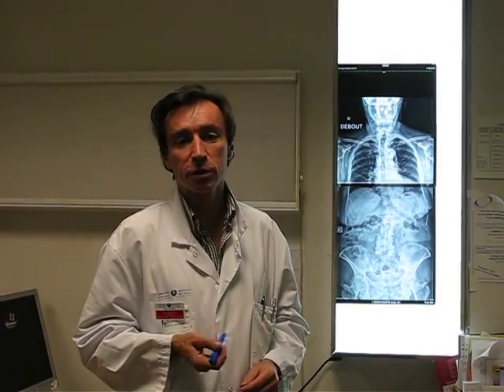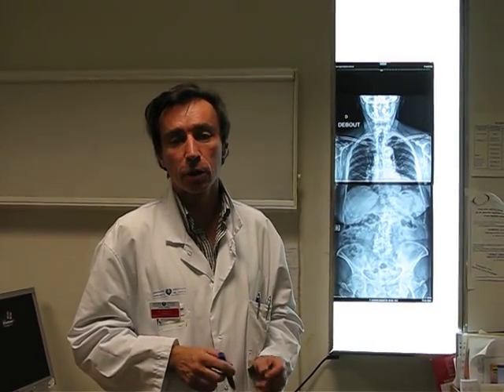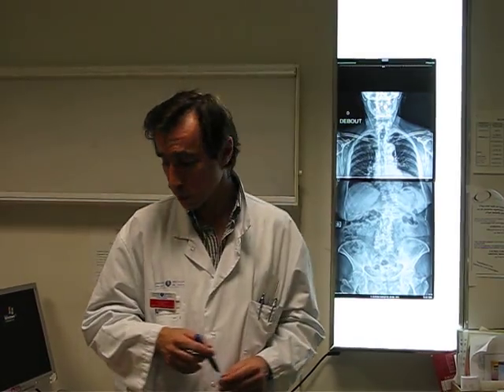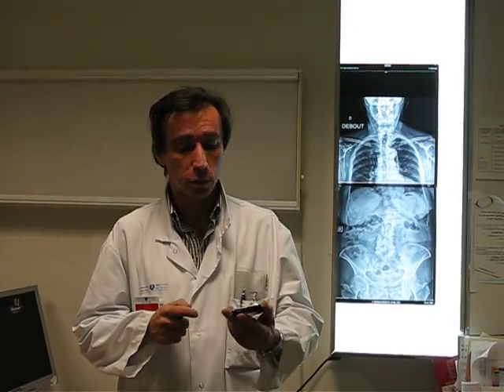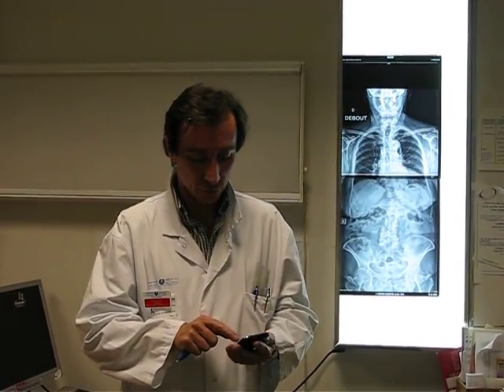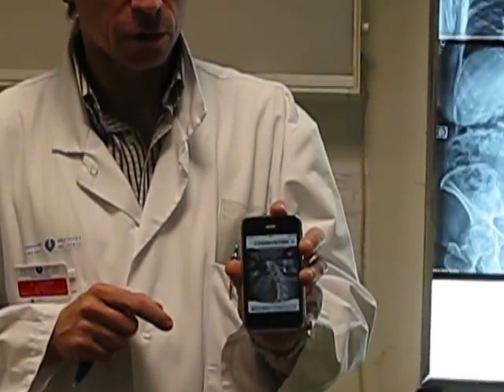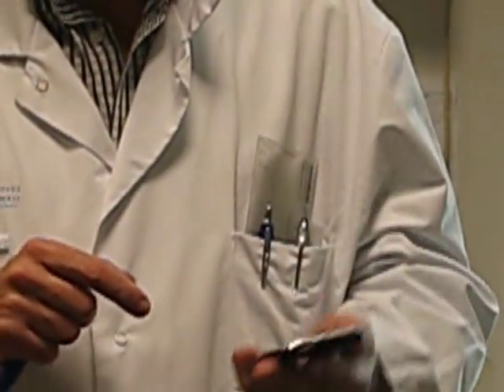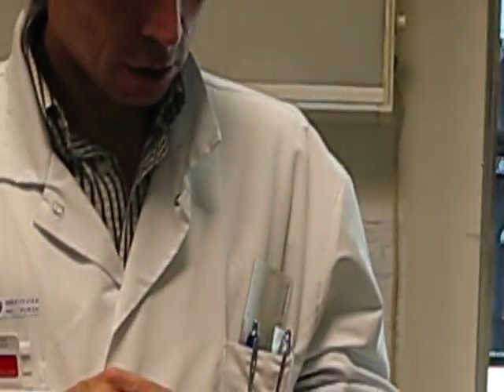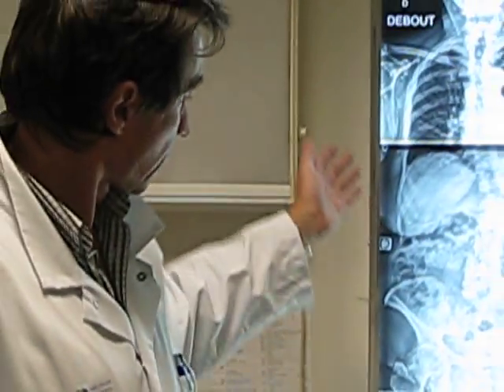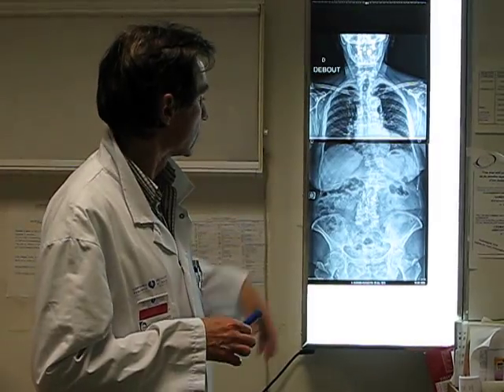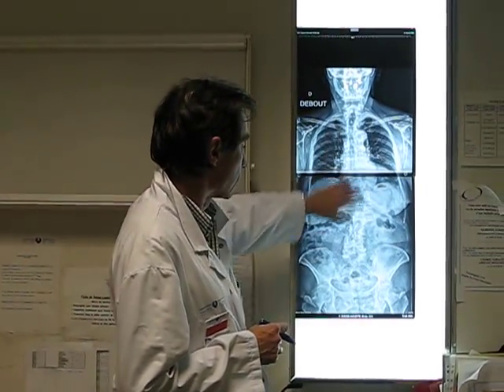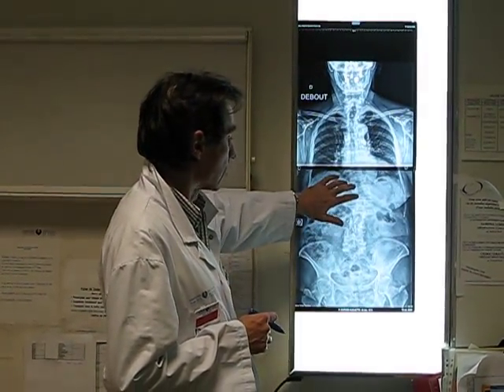Hi everybody, my name is Frederic Jacou. I'm a spine surgeon here in Paris and this video is made to demonstrate the functioning of this software we developed on the iPhone I use every day. This is a large x-ray of a patient with severe degenerative disorder which is scoliosis, degenerative scoliosis in the spine.